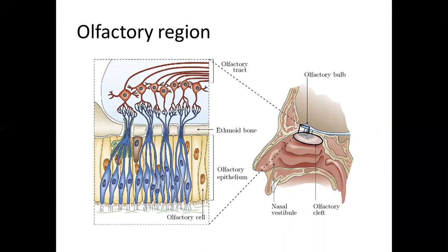Number two is the sustentacular cell, which is a columnar cell whose apical aspect has a serrated border composed of microvilli, and it has a role in physical support, nourishment, and electrical insulation for the olfactory cell. So its functions are nourishment, regulation, and support.